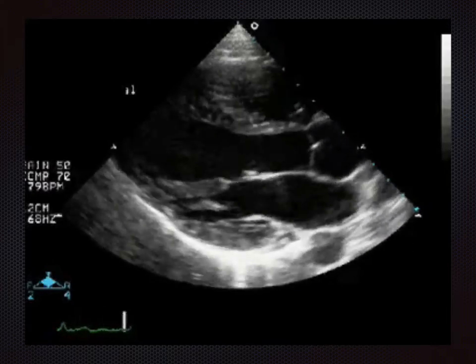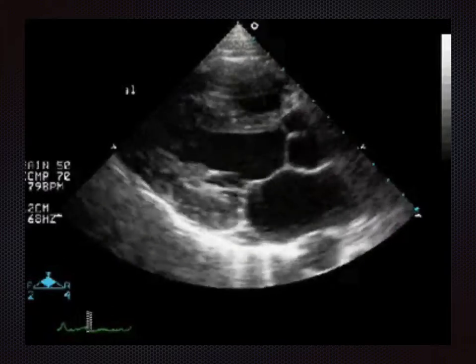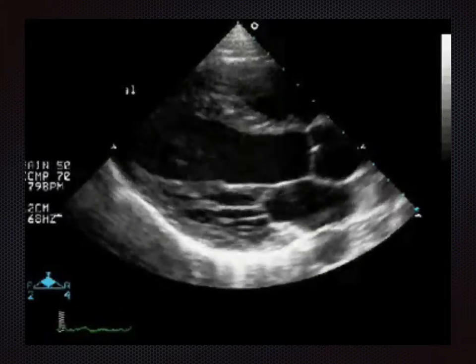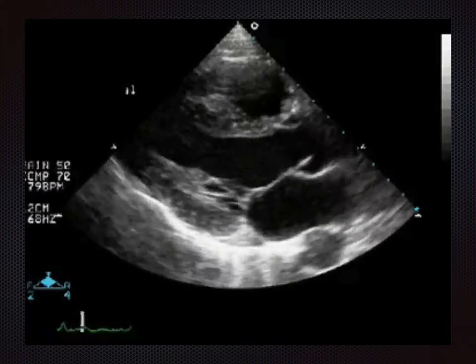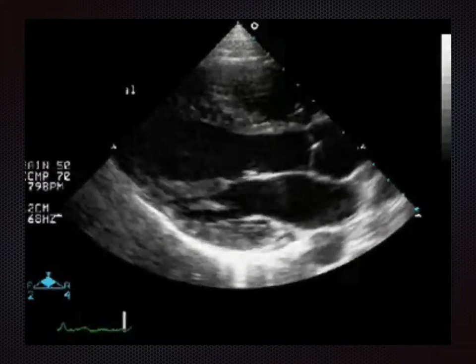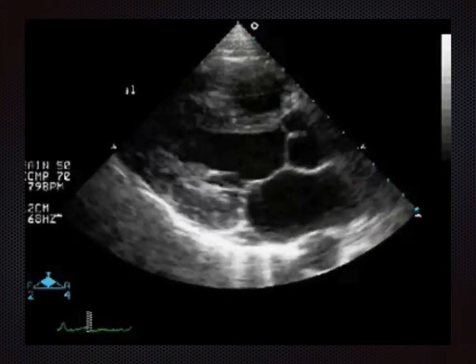So looking at the thickening, looking at the radial contraction. And also there are some spiral fibres which cause a shortening of the length, but this isn't very well appreciated on this view. But really the key message is look at the thickening by 30 to 40% and look at radial contraction, i.e. a narrowing of the internal lumen of the left ventricle due to contraction of the left ventricle muscle by about a third in this view. That's actually called fractional shortening if you're interested.